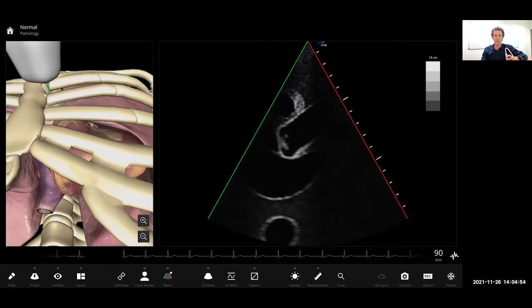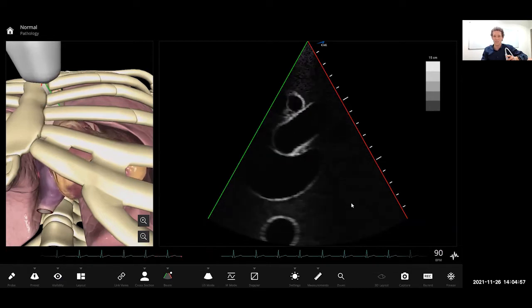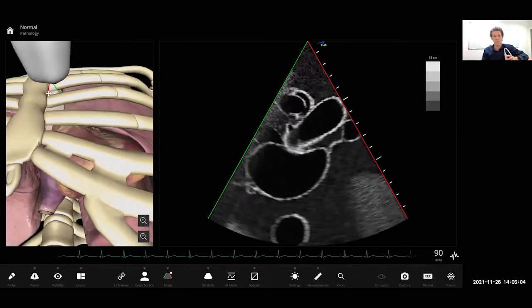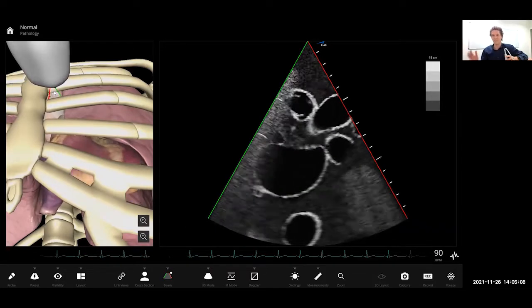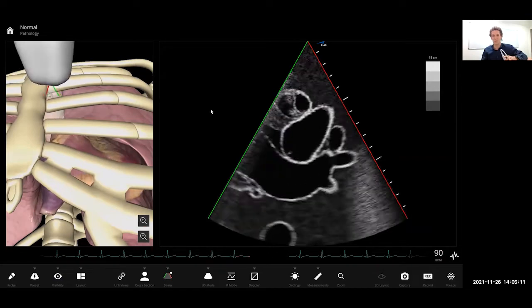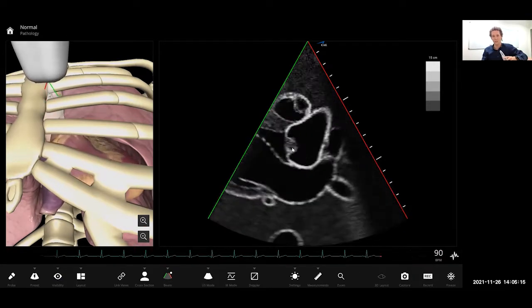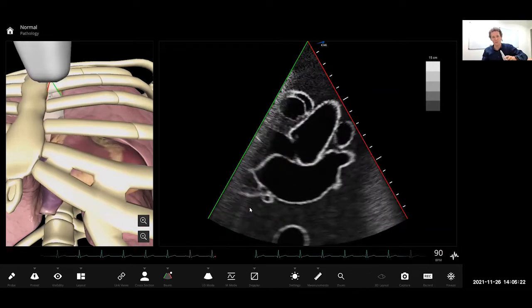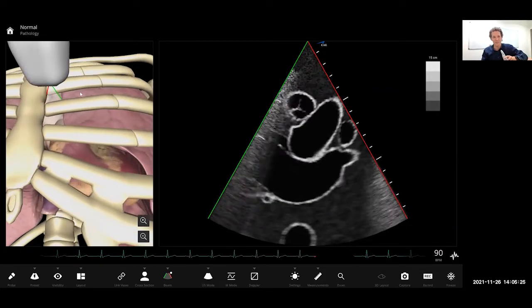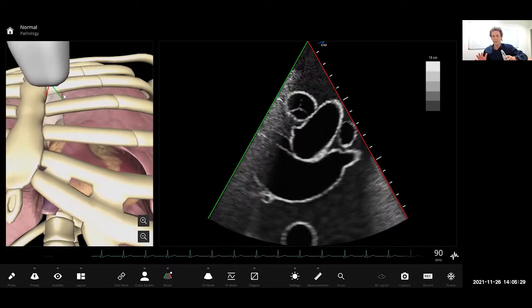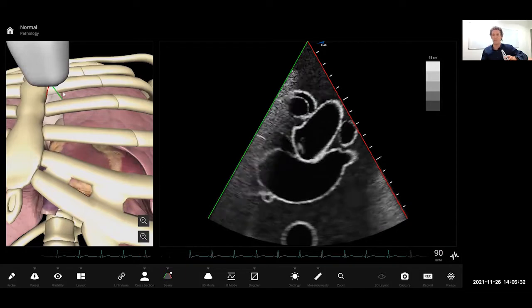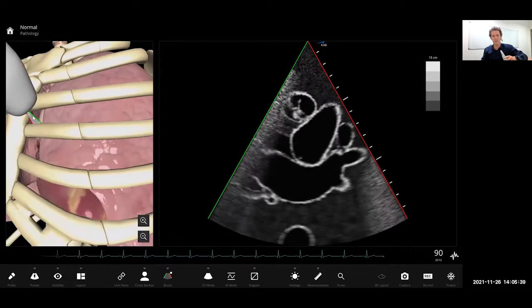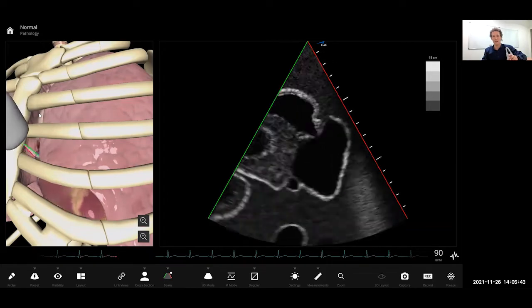Sometimes you've actually got to put your ultrasound beam right on the sternum, causing a shadow artifact to appear — that tells you you're actually right there, almost looking in that 20-cent-piece area in the third intercostal space, trying to get your parasternal long axis image with the aortic valve in the middle. If you've got a COPD patient or someone mechanically ventilated and you're not getting the view you want in the third intercostal space, try moving down a rib space.